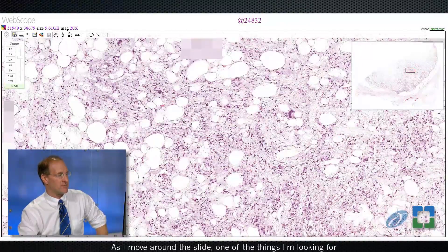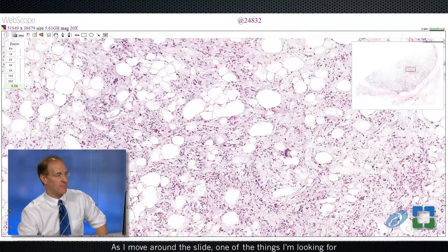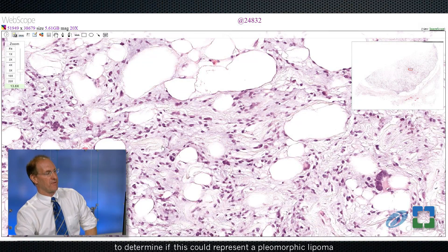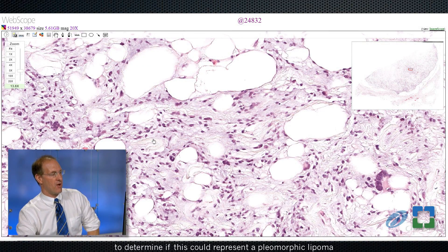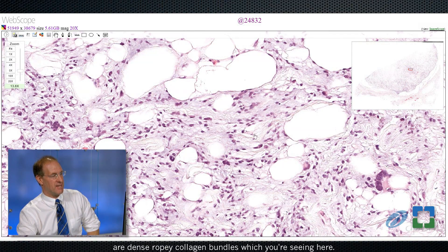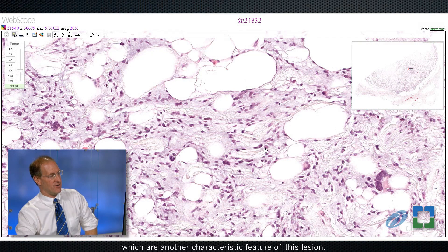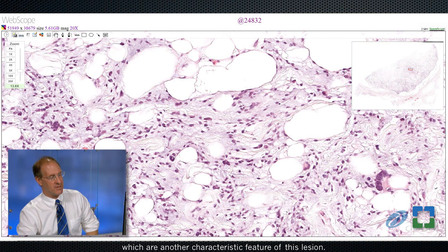As I move around the slide, one of the things I'm looking for to determine if this could represent a pleomorphic lipoma are dense, ropey collagen bundles, which you're seeing here — these eosinophilic collagen bundles. You can even make out some mast cells, which are another characteristic feature of this lesion.